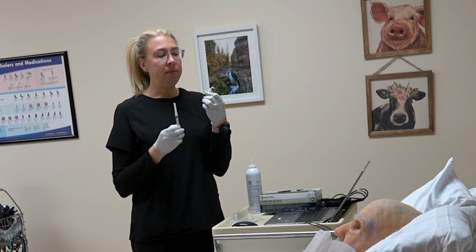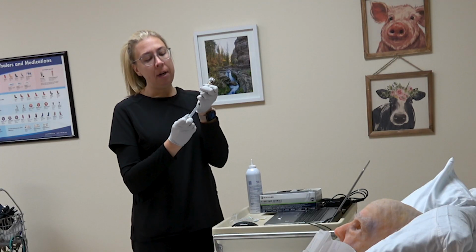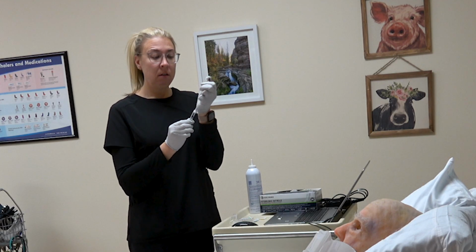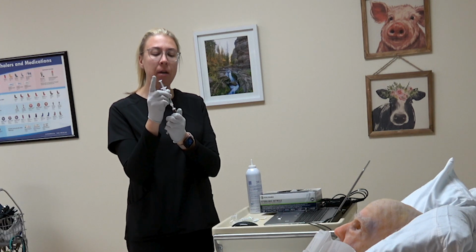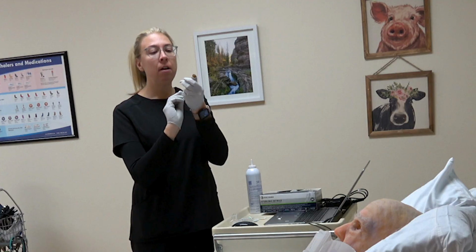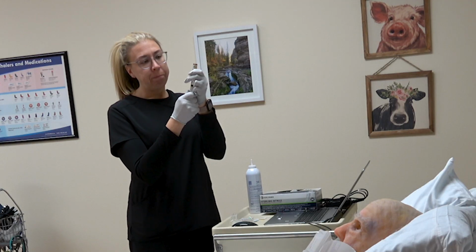Now I'm giving 15 milligrams of Toradol, so this is 15 milligrams per milliliter. I'm going to draw up 1 milliliter of air. Take off my cap of my needleless cannula. We're going to go ahead and push that into that rubber part on the top of the medication, inject that air, flip it upside down, and we're going to draw this medication back and out.